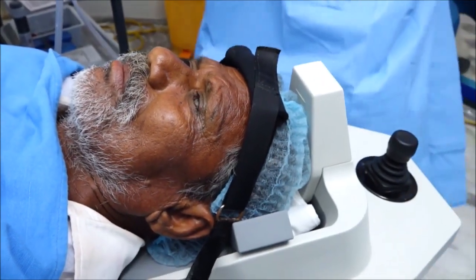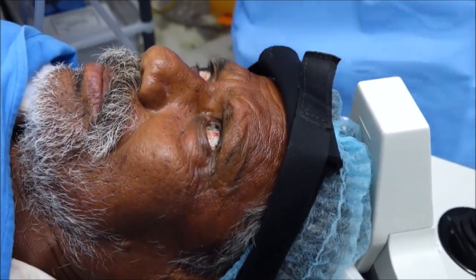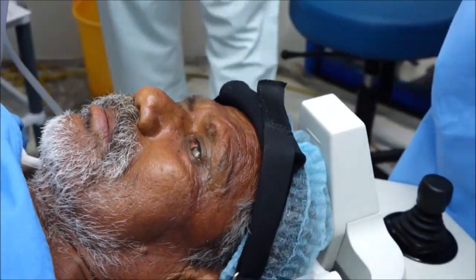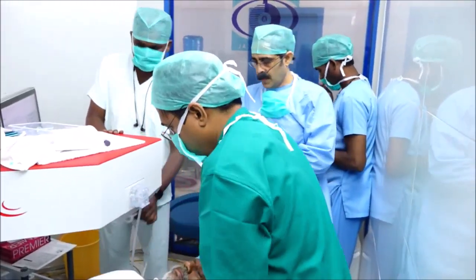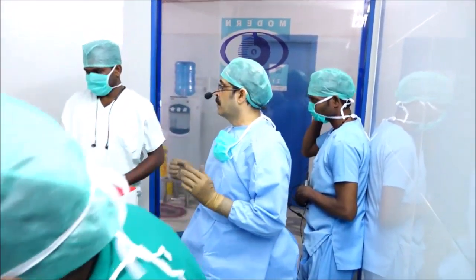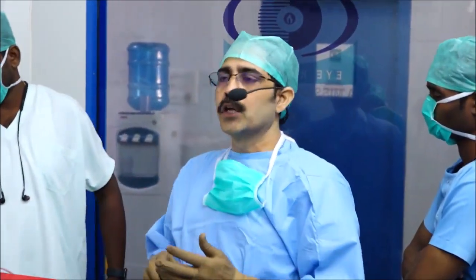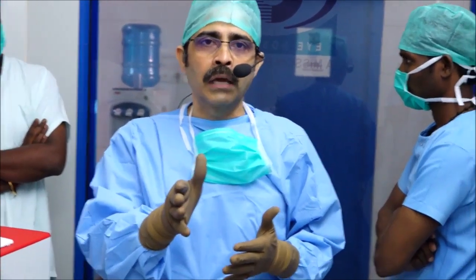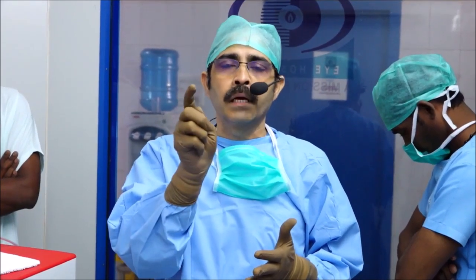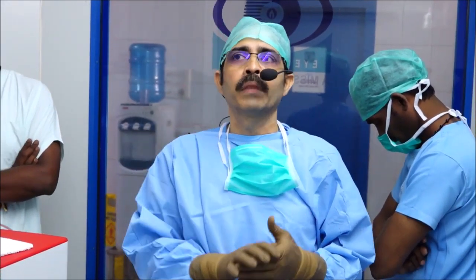The patient is ready to be shifted to the main operating room where Dr. J.K. Reddy is going to perform the rest of the procedure — the phacoemulsification part. The main advantage of this femto laser machine is it can reduce phacoemulsification time and energy, whereby the cornea is clear the next morning. The second advantage is the capsulotomy size and shape. In case of premium IOLs — toric and multifocal — where you want exact centration of the IOL in the capsular bag, this near-perfect capsulotomy is very beneficial.